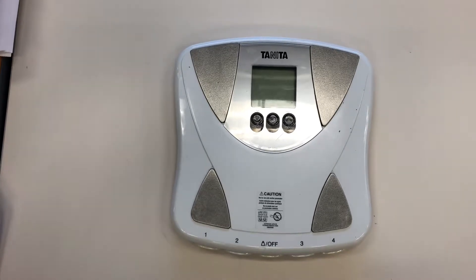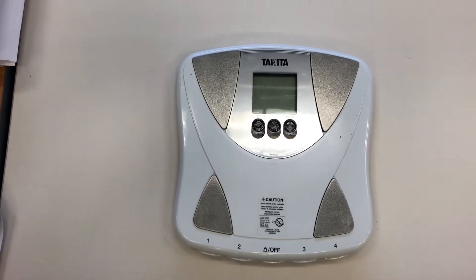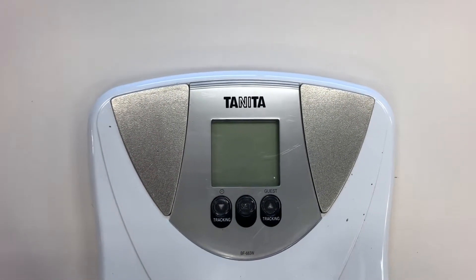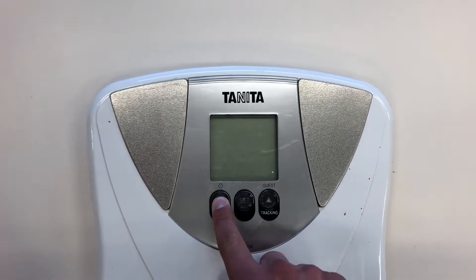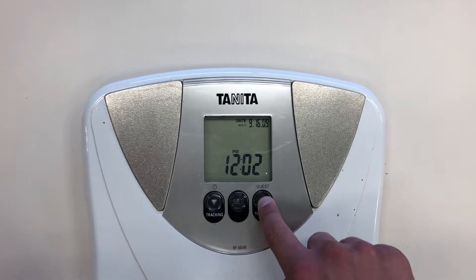First off, you have to program the BIA scale before you can step on as the participant, so we're going to show you how to do that. In order to set the date, while the machine is off, you have to press and hold the down button for three seconds, and then it's going to give you the option to change the year, so we're going to change that to 2019.